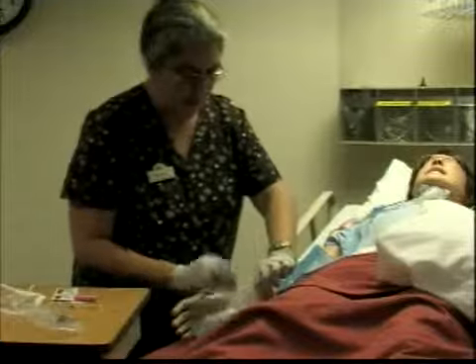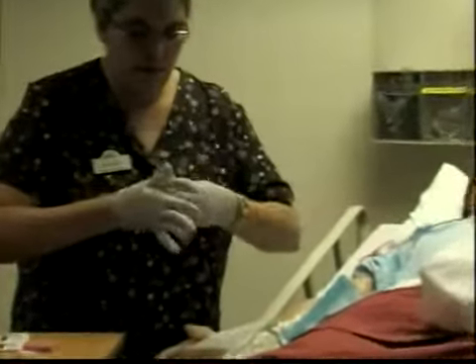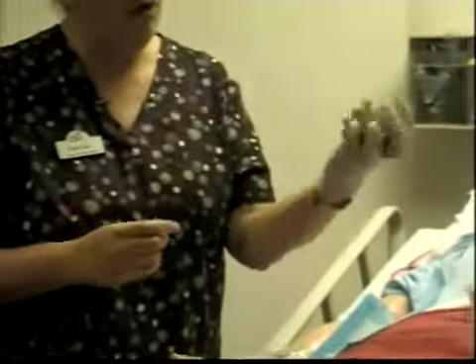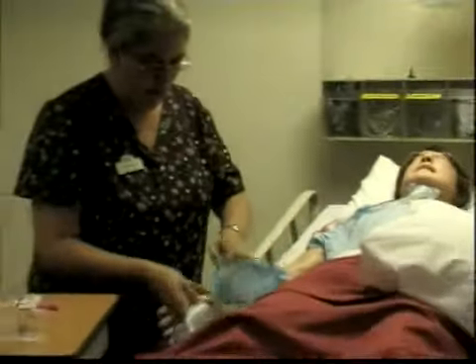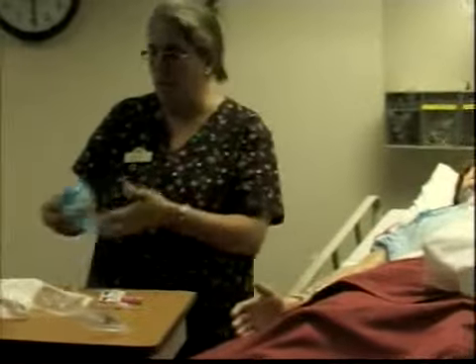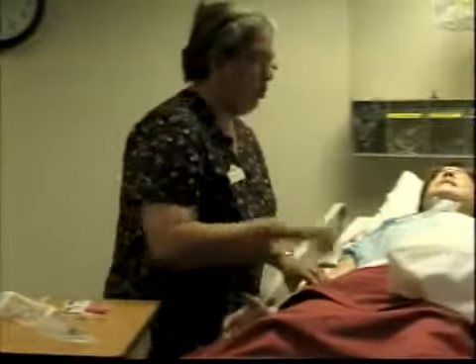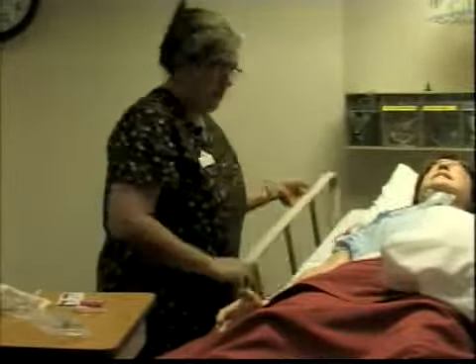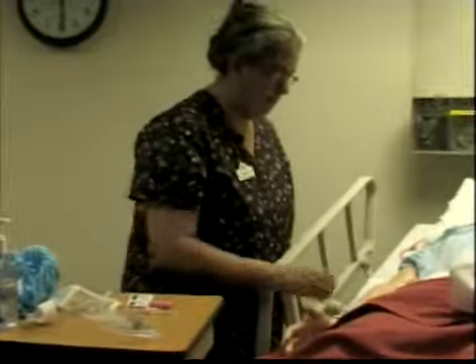Including your gloves. And how do you take your gloves off? You grab it by the middle, make a ball into your other glove, go underneath it, remove them. Make sure you gather everything and put it in the trash bag, on the red bag. Okay? And then you are making sure that you leave your client safe, rails up, whole bed down.